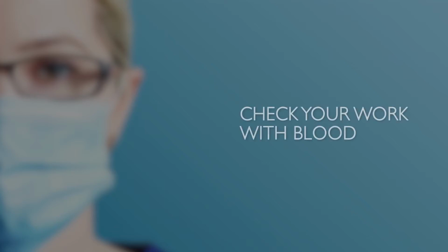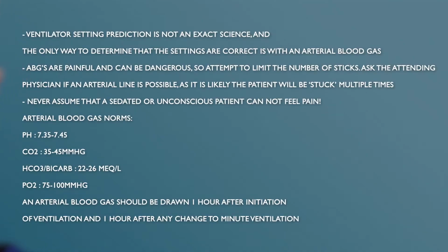Checking our work. After a patient has been on those ventilator settings, looking comfortable, returning to baseline on each breath, which you're going to determine not only by looking at the patient, but also by looking at the ventilator graphics, we're going to get an arterial blood gas.